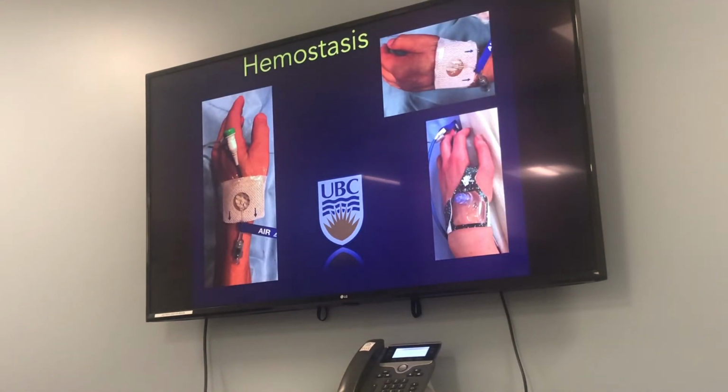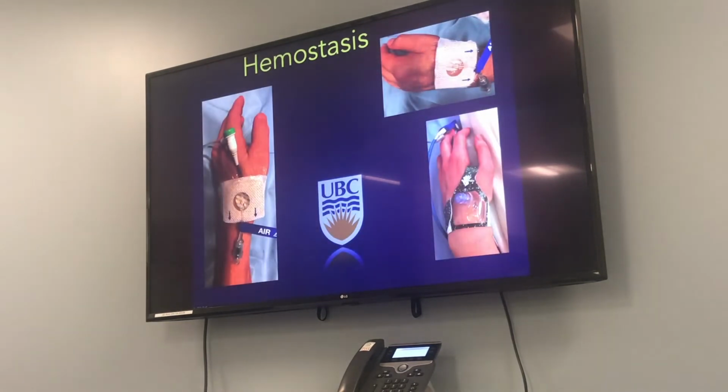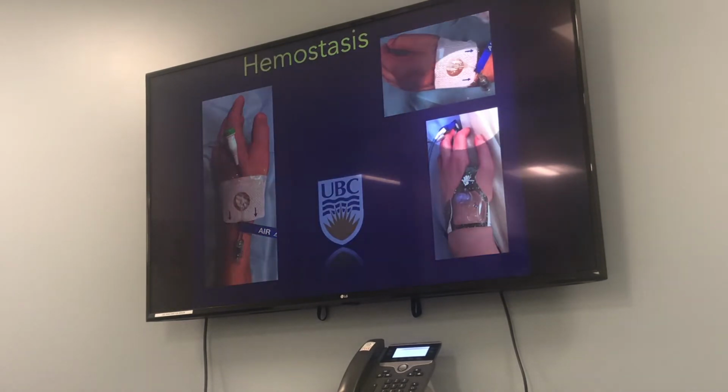And this is what the patients come up with. I think it's pretty rare for us. I think we haven't used the safeguard for a long time, at least for snuff box access, because we have this now, which is the sync distal. So the only difference between these two devices is that the balloon's a bit bigger on this, and this is a sticky one. But I think most of the time for snuff box access, you'll probably see almost always this one.